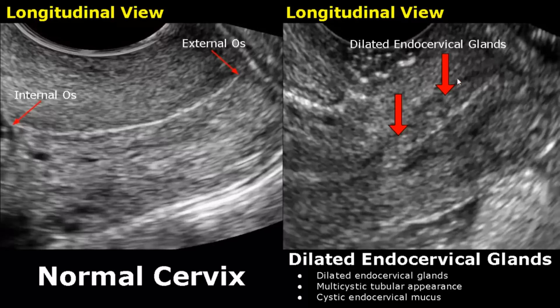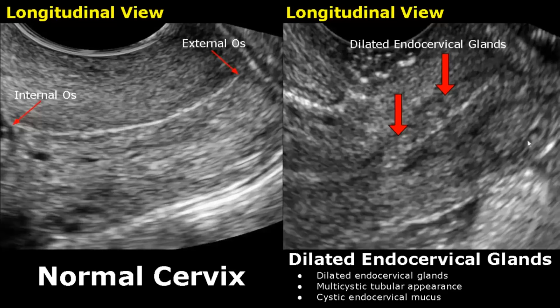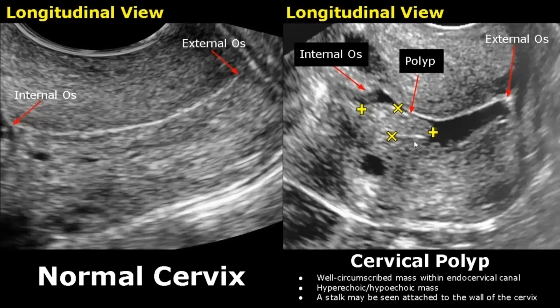Dilated endocervical glands will have a multicystic tubular appearance, also called cystic endocervical mucus — you can see a difference in appearance of the cervical canal. A cervical polyp refers to a well-defined circumscribed mass within the endocervical canal, attached to the wall of the cervix with a stalk that is hard to see on ultrasound. This mass can appear hyperechoic or hypoechoic, but mostly it is hyperechoic to the myometrium.